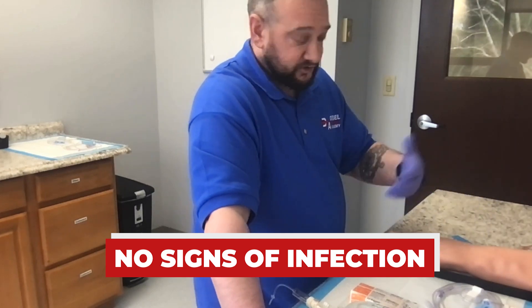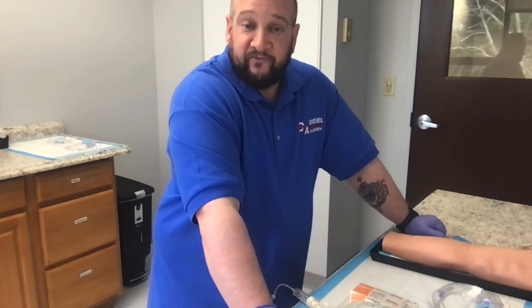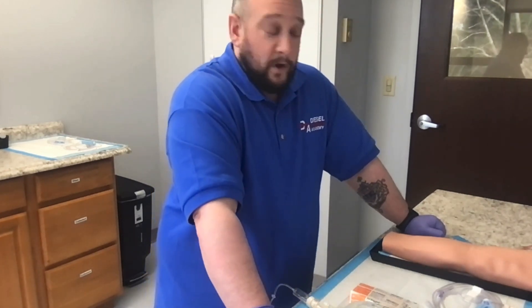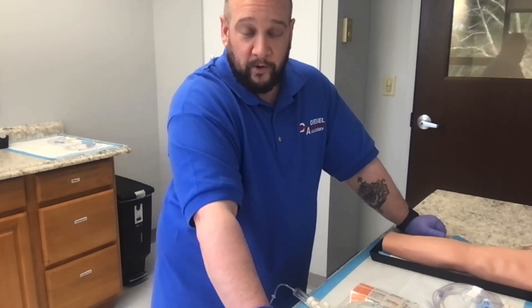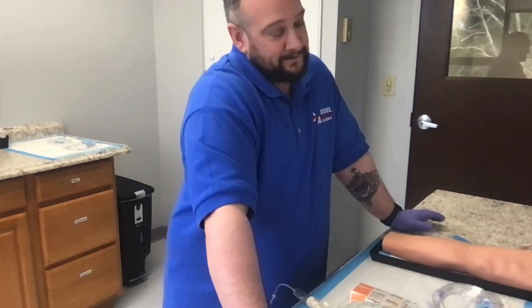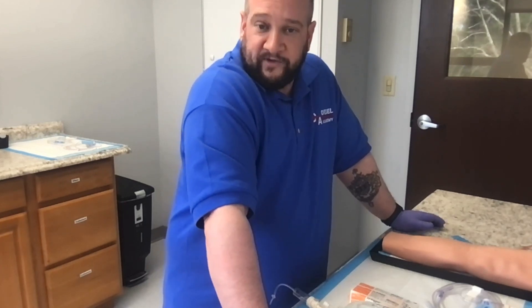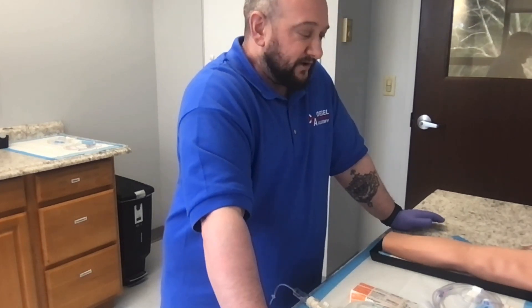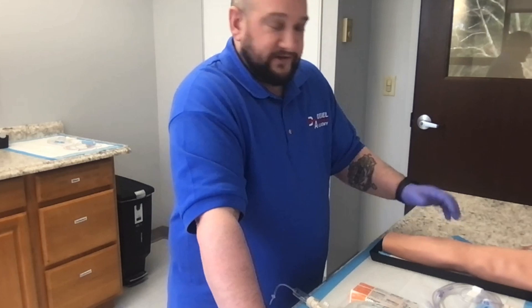When you approach the patient, introduce yourself: 'Hi, my name is Joe, I'm a paramedic. I'd like to start an IV today and get you some fluids to help you feel better — is that okay?' Allow the patient to say yes or no. Then ask: have you ever had an IV before? Is there one arm that's better than the other? There's nothing more embarrassing than a patient saying 'they never get it here, they always go there' — and then you go to the wrong spot and blow it. Listen to your patient; they know their body.